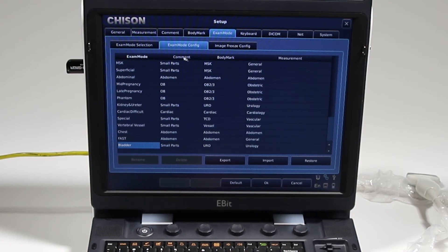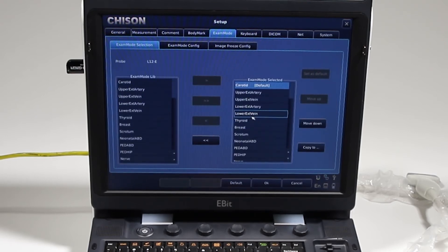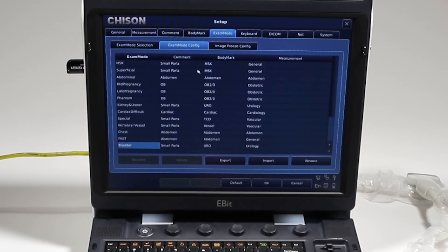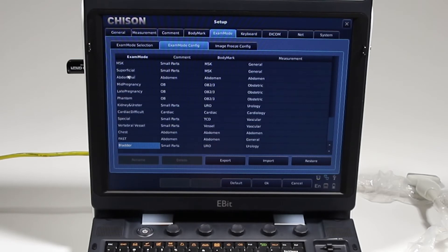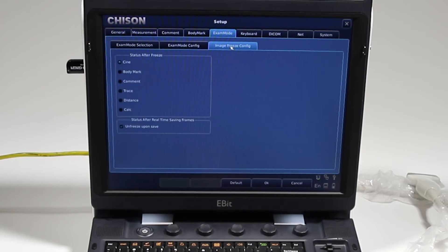Body markers: same thing. Exam mode, we took a look at this before where we can add and remove from that default screen what's going to show up. We can change the comments, body marks, and measurements that appear for each one of those measurements. Image freeze configuration.